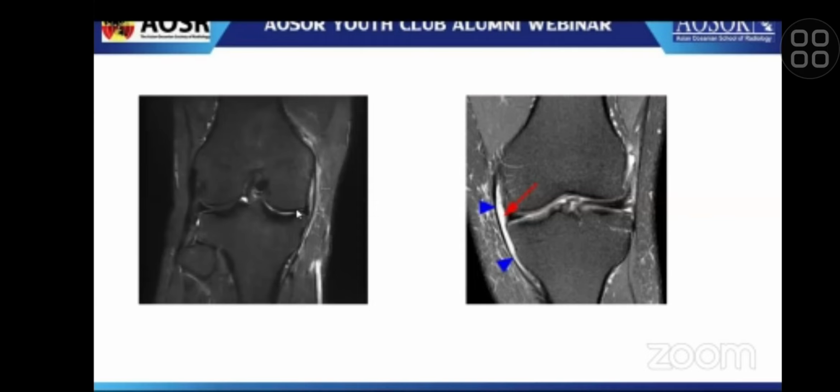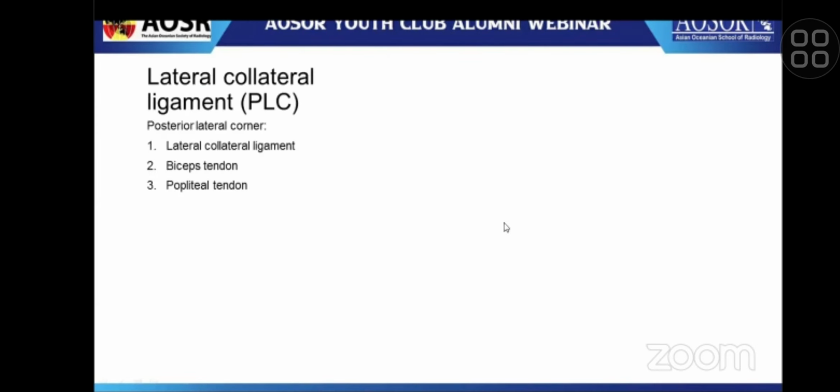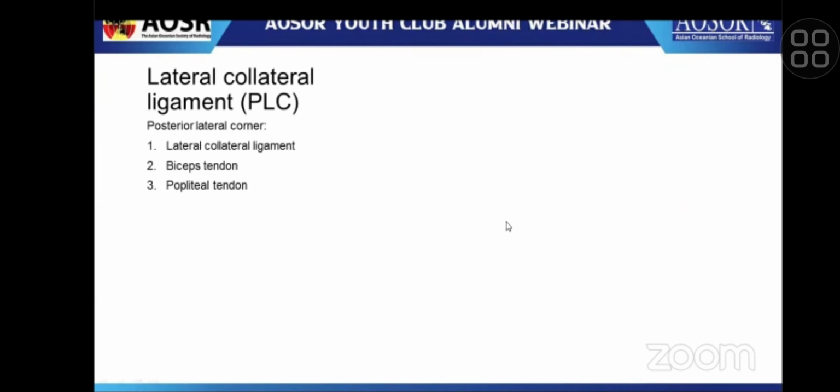And we should differentiate between a first grade injury of the medial collateral ligament and medial collateral ligament bursitis. In the injury, we can see soft tissue edema in the outer portion of the superficial bands of the ligament. In contrast, in medial collateral ligament bursitis, we have a bilobulated fluid collection that originates between the superficial and deep layers of the medial collateral ligament.